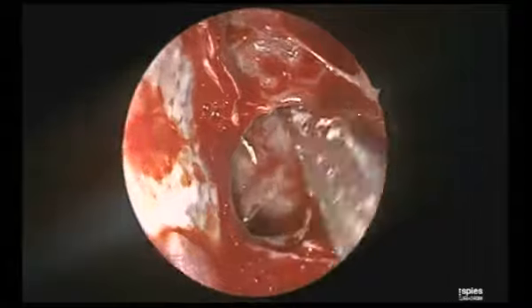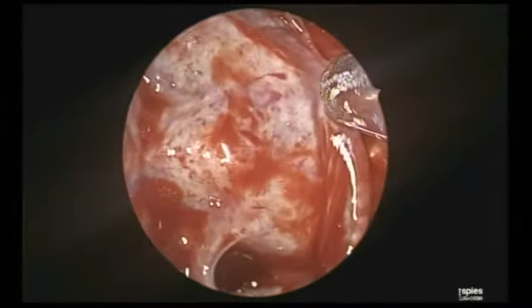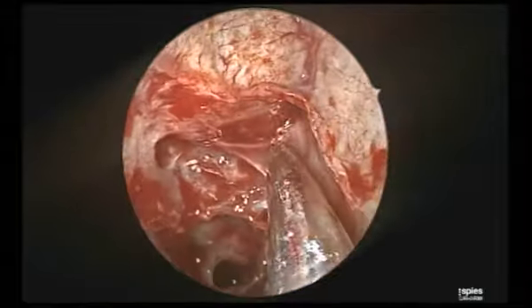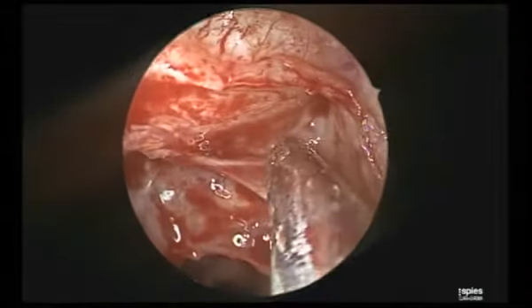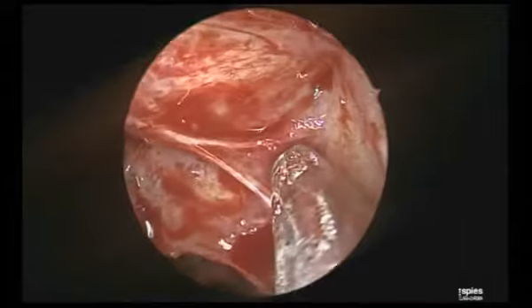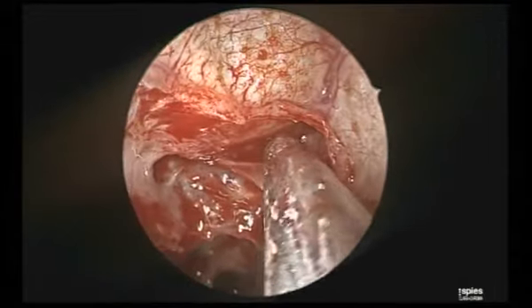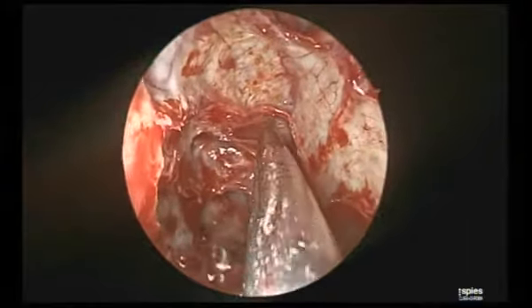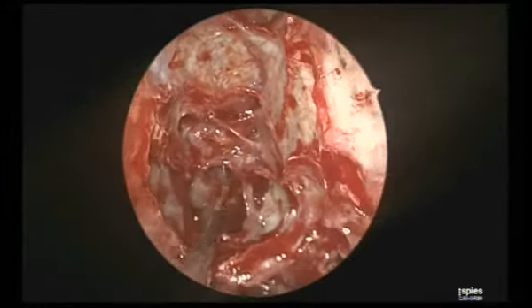That's the optic nerve here. See that whitish prominence, and my post-ethmoidal artery should be somewhere here. Can you see this structure? Yes, this to me looks like the post-ethmoidal artery. But this has theoretical importance, nothing to do with the surgery. You need to preserve these vessels.